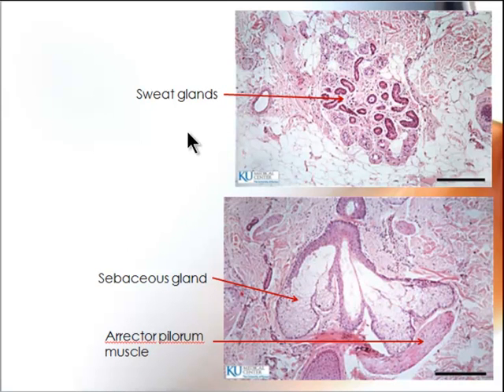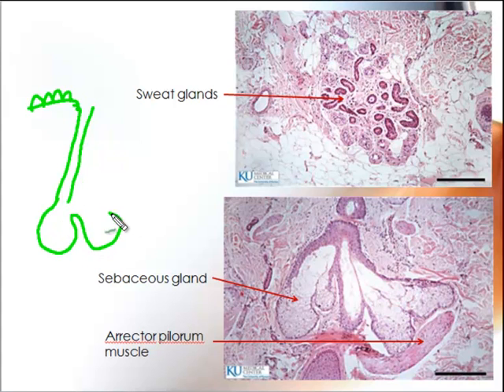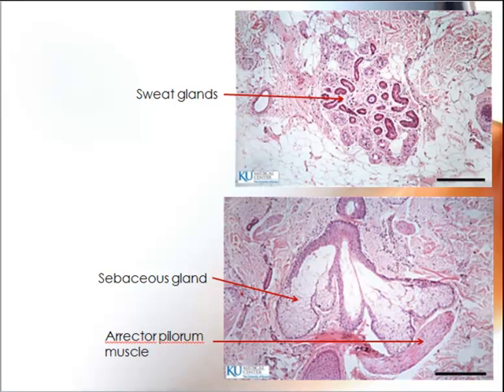And then let's see what else we see in skin. If you remember, when you do tissues, we talk of glands, and these are what are called exocrine glands. And exocrine glands are formed from the epithelium. So if this is the epithelium, it sends in a tube, and this kind of enlarges and becomes flask shaped or a different shape. So this is the glandular portion, and this is the duct. So here what you're looking at are the sweat glands. So these are all the sweat glands. Those are cut sections of the sweat glands seen in this dense irregular connective tissue.